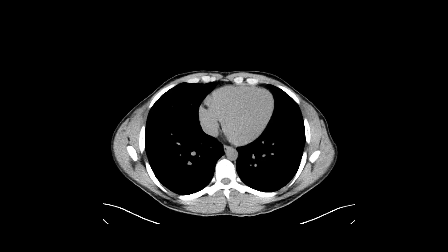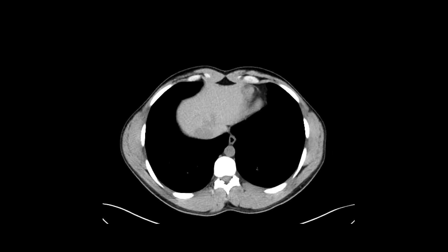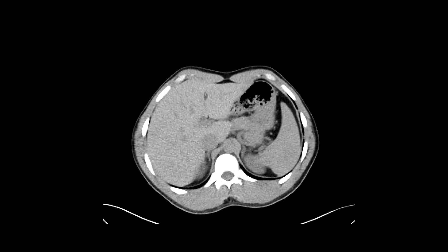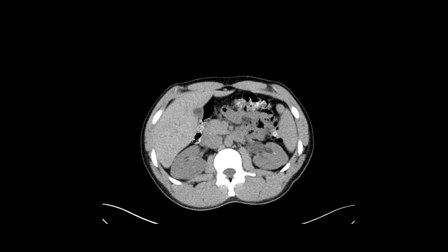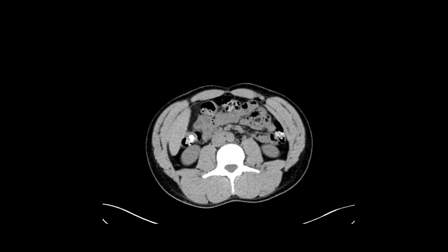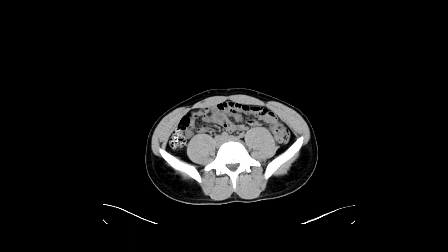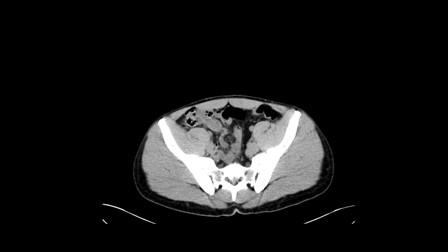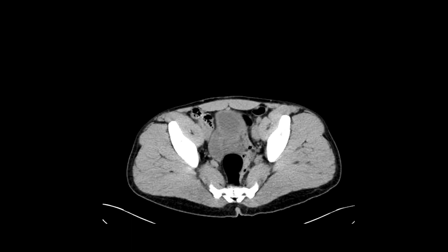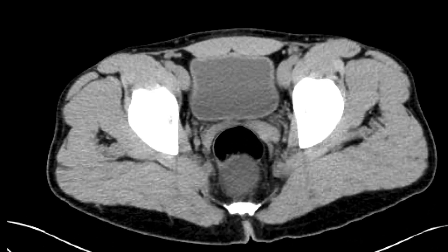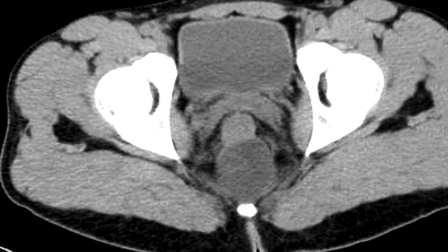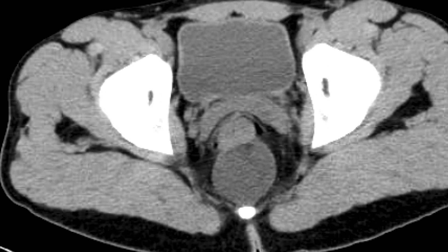Here we have a 30-year-old gentleman with a history of abdominal and pelvic pain, for which we got a CT scan of the abdomen and pelvis. This is without intravenous or oral contrast. As you scroll down to the pelvis, we can see a pretty well-circumscribed mass in the presacral space.